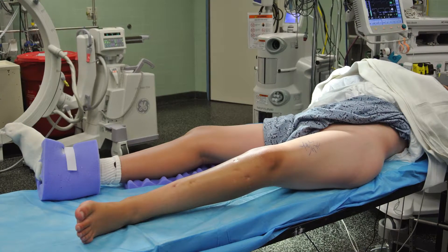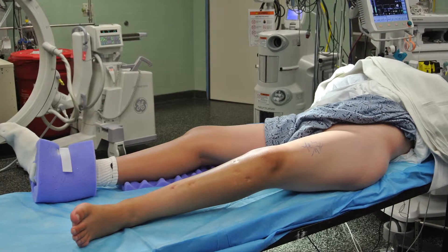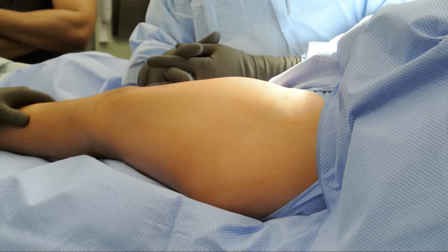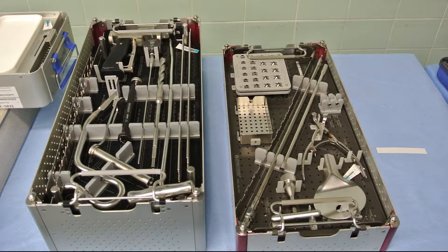The patient is placed supine on a radiolucent table. The ipsilateral upper extremity is positioned over the chest, and the entire lower extremity, as well as the hip and torso area, are prepped and draped in a sterile fashion. Additional instrument trays have been necessary in the past for the proper entry point instrumentation as well as to perform flexible intramedullary reaming. More recently, the company has included most of these instruments in their own instrument trays.